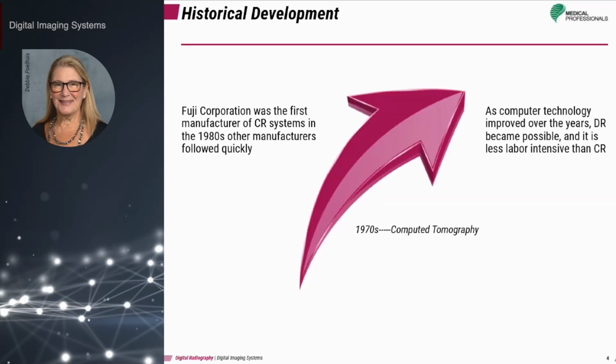As computer technology improved, and as more vendors entered the marketplace, the aforementioned problems were resolved. Digital imaging has now become the gold standard for medical imaging departments and is employed in every imaging modality.